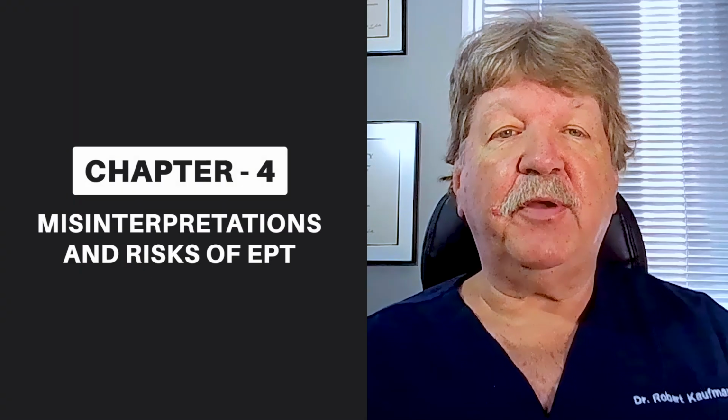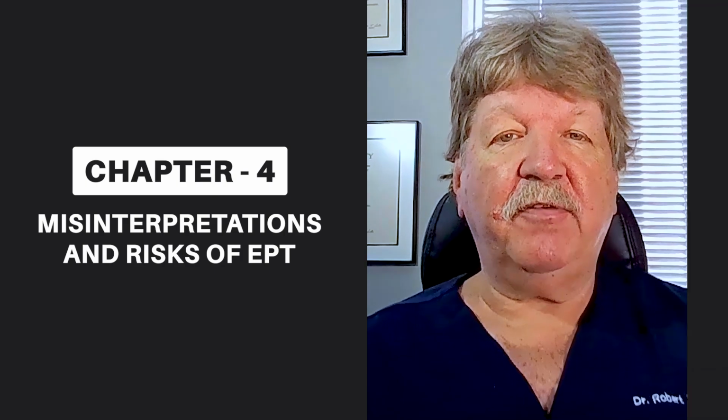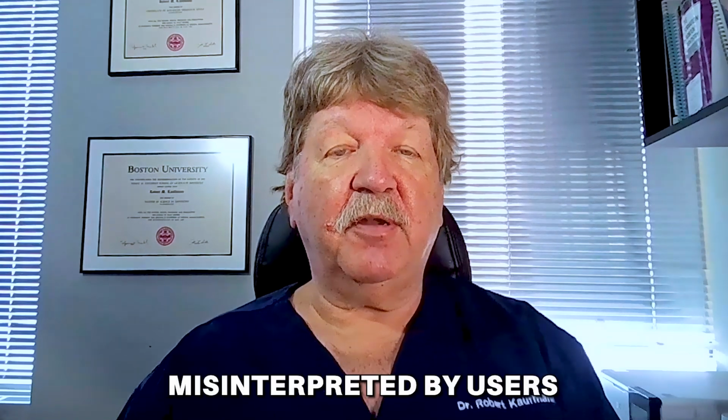My referrals will frequently send pulp tests with numerical values when they refer their patients. The amount of electricity applied to the tooth is usually displayed by means of a 2-digit number. While this may be well-meaning, it really doesn't provide much information other than the fact that the pulp showed either no response at all or at least some response. Unfortunately, the way that these devices work is frequently misinterpreted by users.